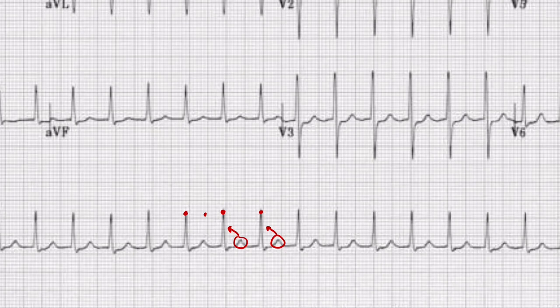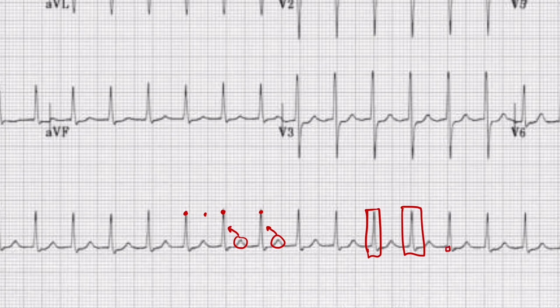Next we'll take a look at the QRS segments. We can see that these are nice narrow QRS segments — maybe one and a half to two small boxes. As you may recall, the small boxes correspond to 0.04 seconds or 40 milliseconds, so we can say this is definitely less than 120 milliseconds, which corresponds to a normal QRS.